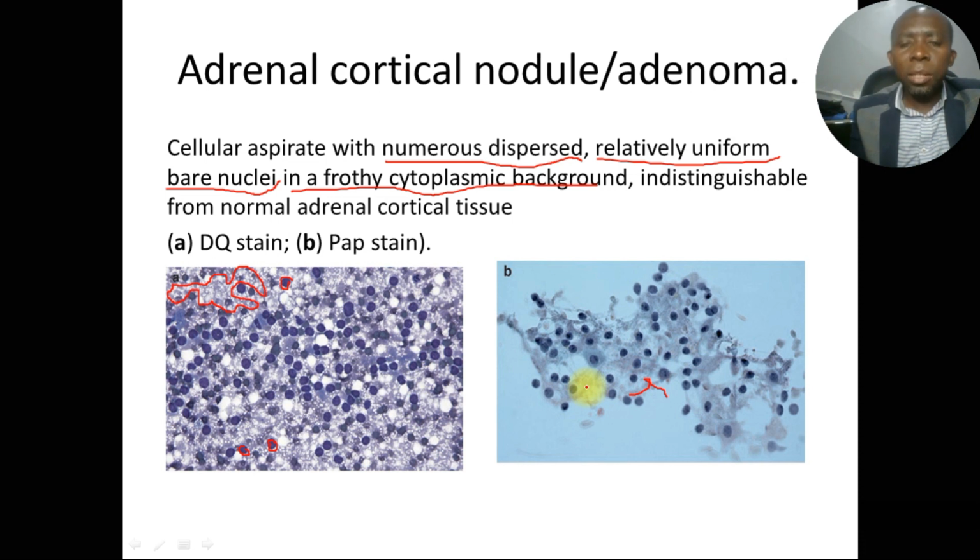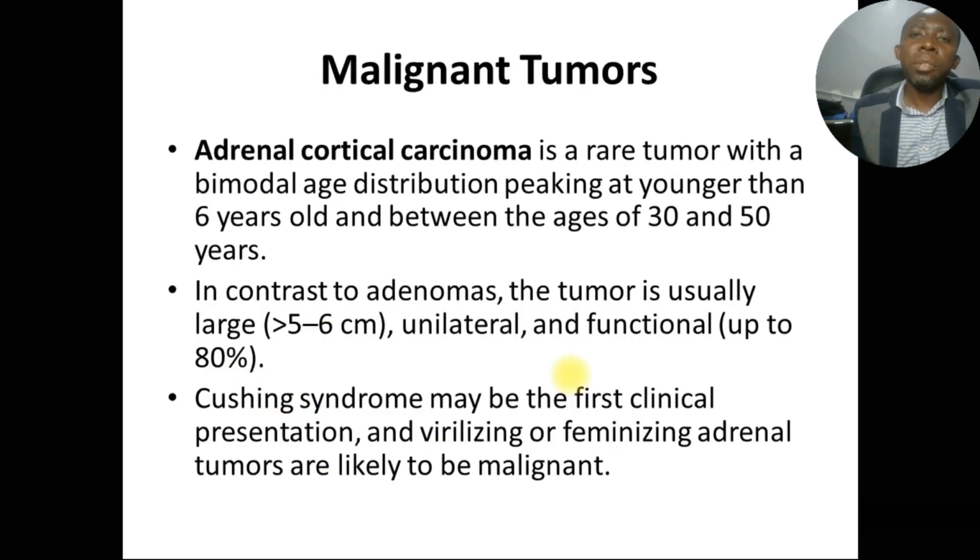And at some point we said there is vacuolation in the cytoplasm and the nucleus for some cells. Under higher magnification, for example, we have this cell here with some vacuolation. If you take keen interest to look at it, and even the cell here, you can see it, but under higher magnification that can be really appreciated.